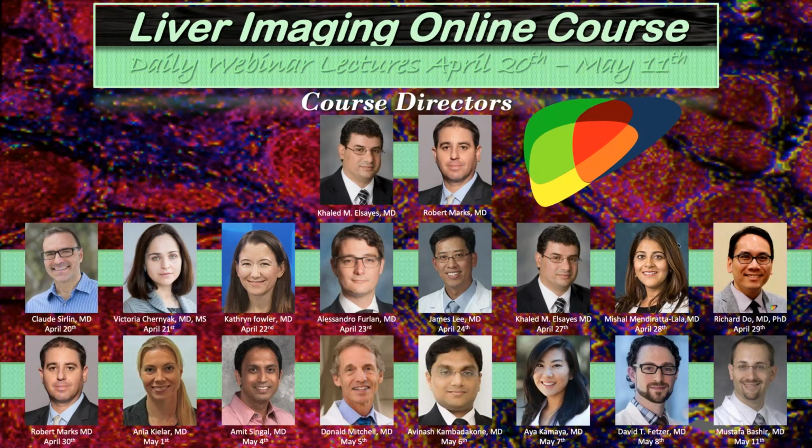Yeah, there are ancillary features, and they are listed. They tend to be stronger for establishing hepatocellular. So, for example, if there's fat in there, then it's going to be LI-RADS 4 or 5, not M. Capsule, that's going to be LI-RADS 4 or more likely 5.